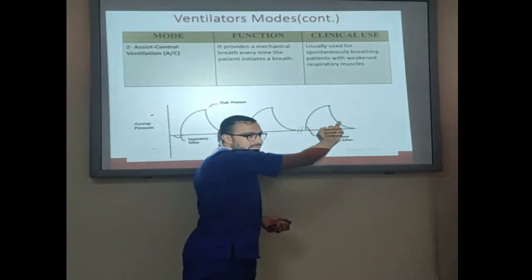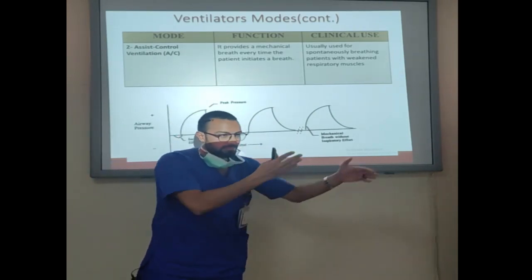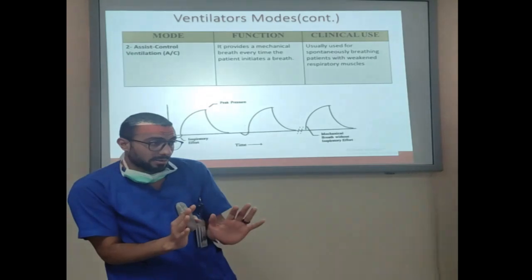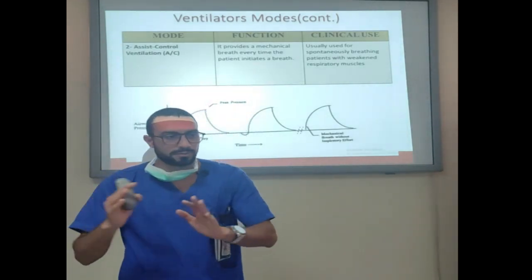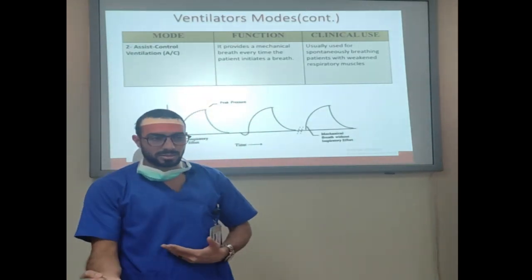The ventilator will give. So it's a time cycled mode. I mean time cycled, it's a fixed time of the respiratory cycles. But it allows the patient, if the patient tries, it will support. If not trying, it will give. This is assist control.